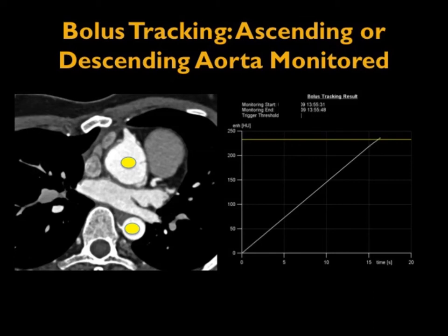Also, the faster the injection will impact your trigger points. So again, you want to become comfortable with one of these techniques. I think it's very important to be consistent in how you do the studies.